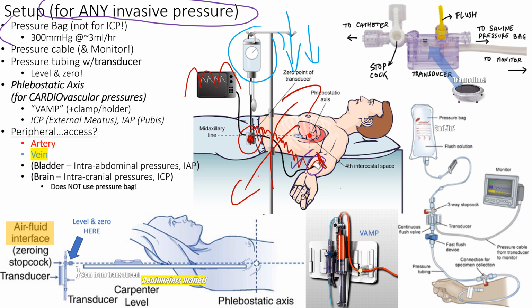It's inflated to 300 millimeters of mercury, so you can get your calisthenics in by trying to inflate this guy, and then you've got to make sure you know which way the stopcock goes, right? Otherwise you have to do it again, all right? And then that's going to be infusing saline at about 3 mLs an hour. So it's pushing on the saline bag that's inside, and that's about 3 mLs an hour on average, right? So in 24 hours, that's how much? 72, right? 72 cc's.